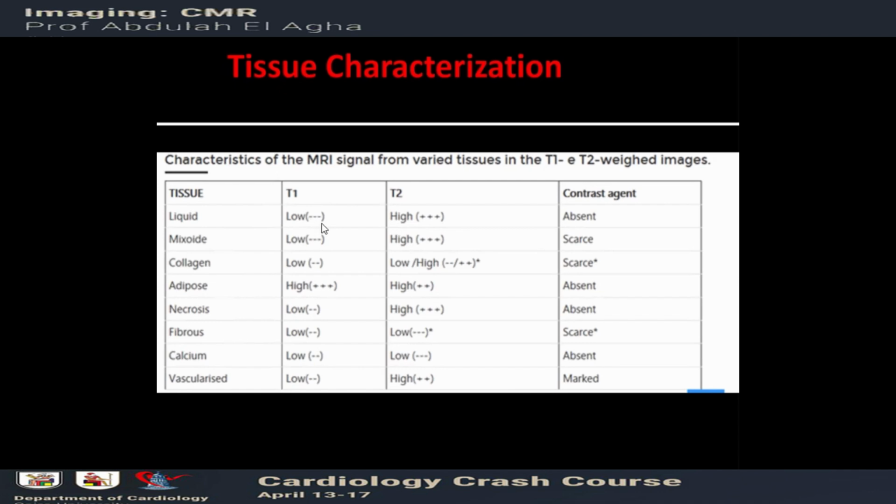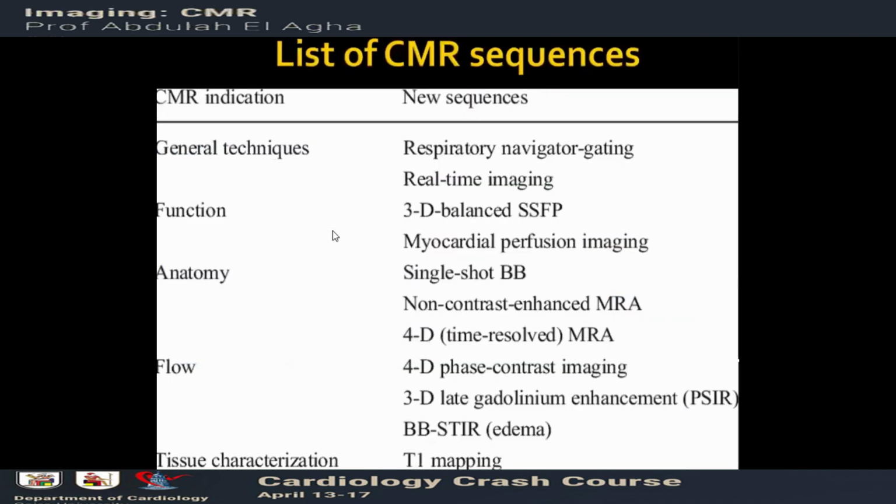عشان كده لما تتسألوا في الامتحان what is the value بتاعت كاردياك MRI، من الحاجات المهمه هو التيشو كاركترايزيشن. ما عندناش موداليتي ثانيه في الكارديولوجي بتديني بنفس القوه بتاعت الكاردياك MRI. دي بيزكس بتاع T1 وT2. طبعا هو ليه شرح طويل ولكن مش في المجال بتاعنا.